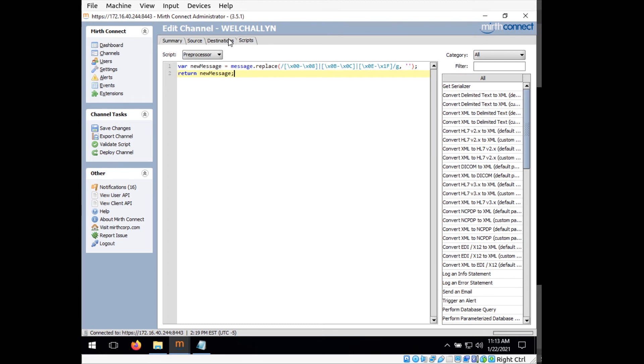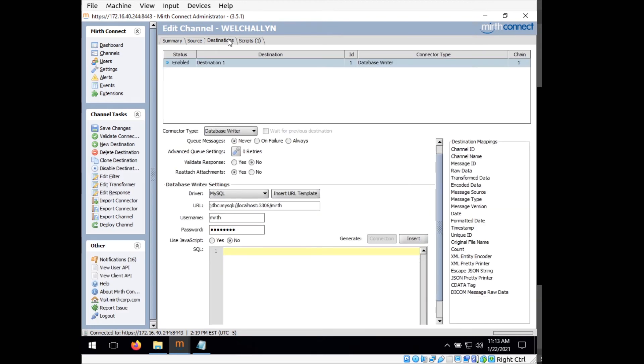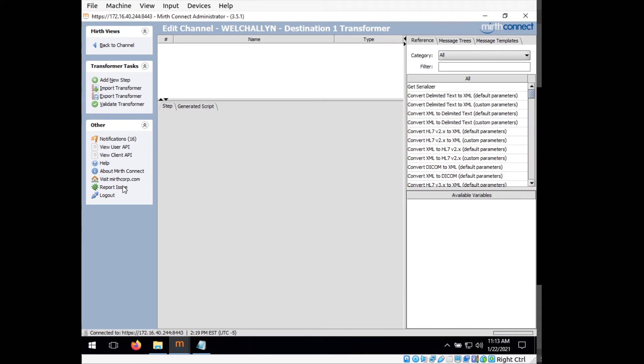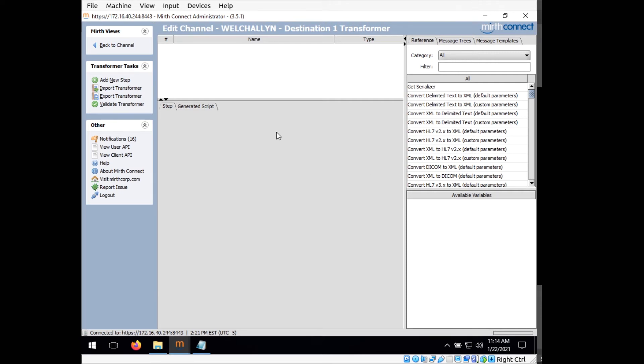So now we can go back to destinations. And now we need to tell Mirth Connect what data we want it to store. So to do that, we go over here to edit transformer. And in here, we're going to pick out the individual pieces of the HL7 data we want to store. This process though is pretty tedious and prone to errors. So instead, what I suggest doing is importing the saved transformer settings that I've already created. So I'm going to go over here to import transformer.